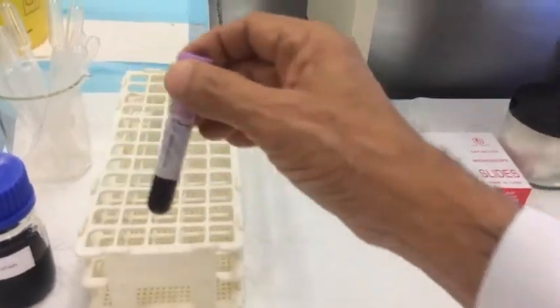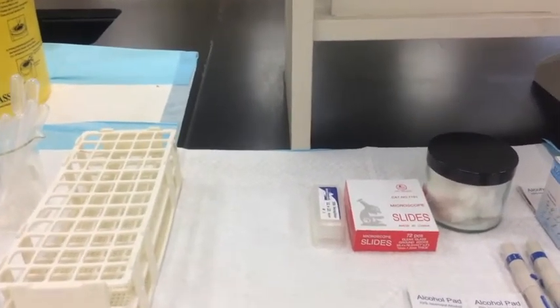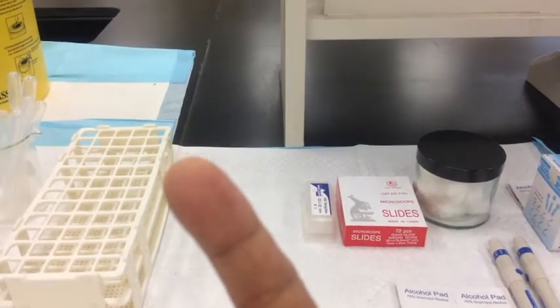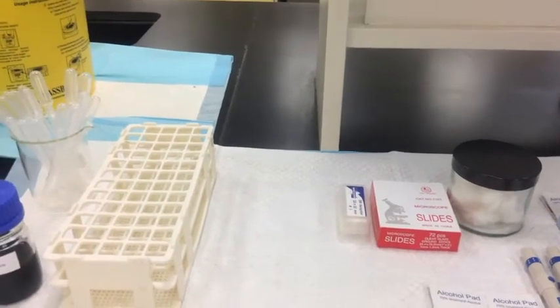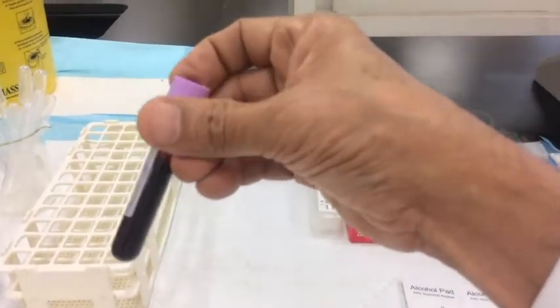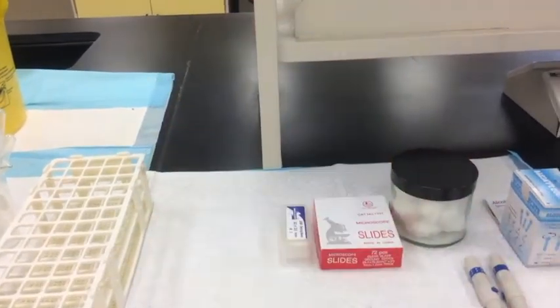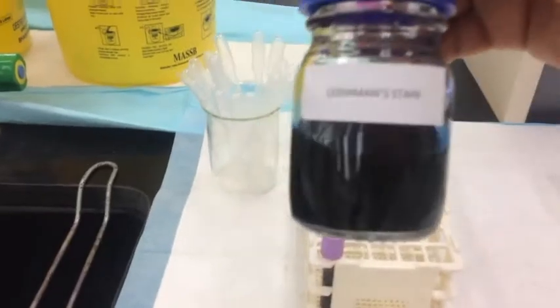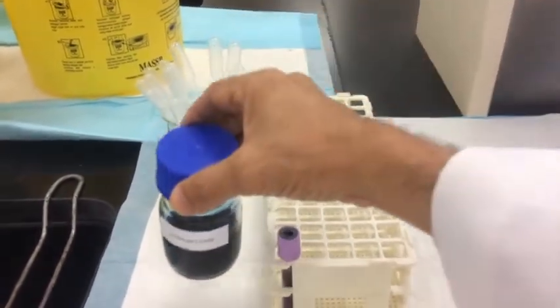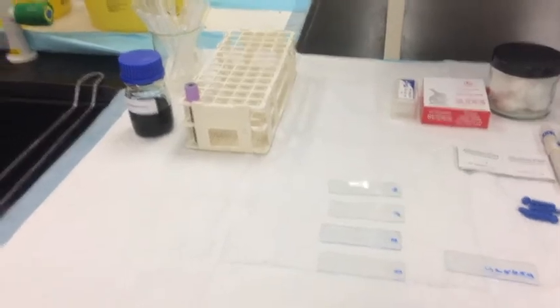We also need cotton balls and the blood sample itself. The blood sample can be obtained as capillary blood from the fingertip, or if you need a bigger sample size, venous blood mixed with an anticoagulant called EDTA. To stain the slides we use the Leishman stain.